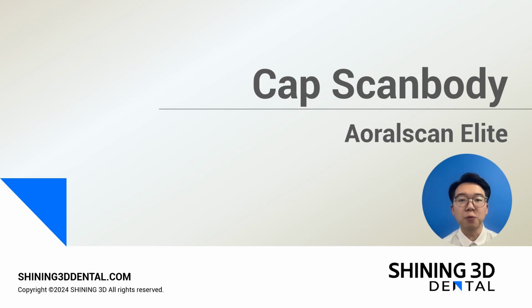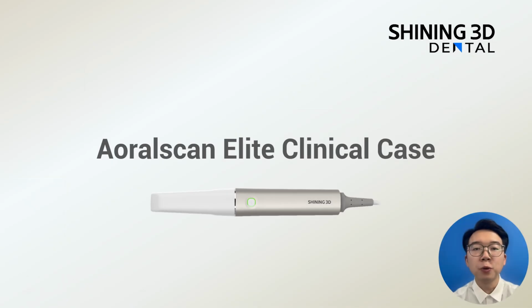In today's webinar, we will talk about the Cap Scanbody and we will also go through some updates for the intraoral scan software. We will begin with a clinical case using the Aoralscan Elite. The Aoralscan Elite is a 2-in-1 system that combines structured light scanning technology and IPG, the intraoral photogrammetry technology.